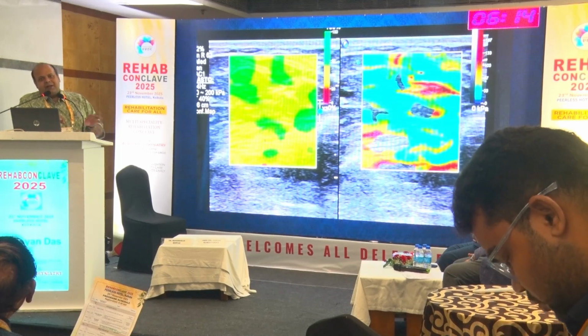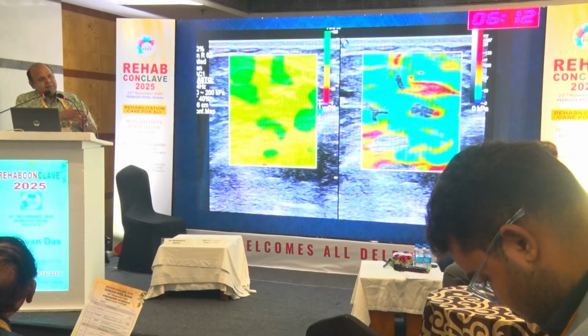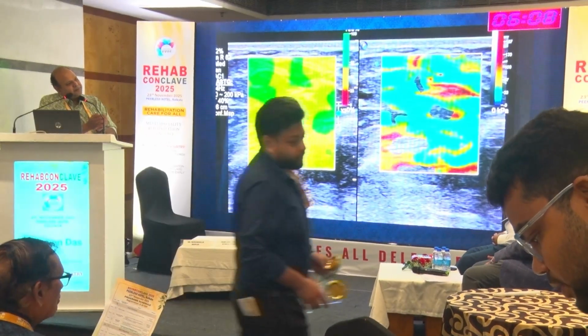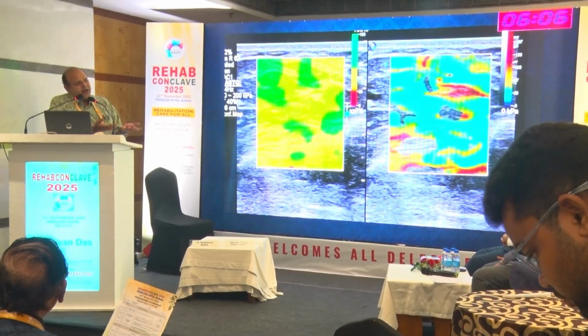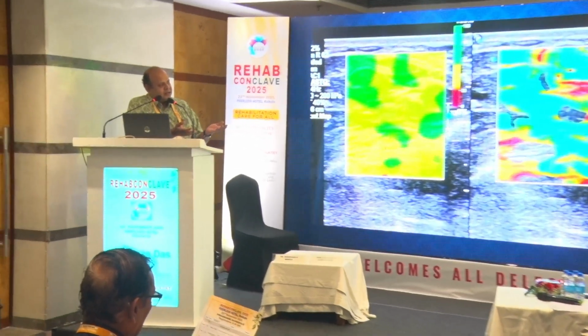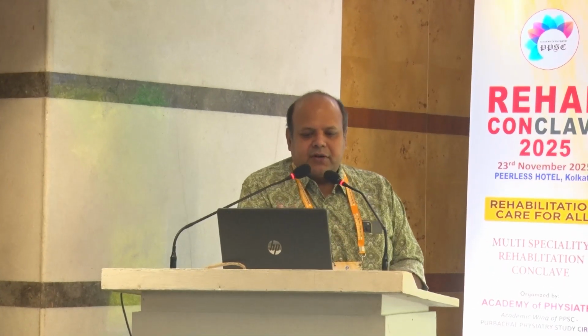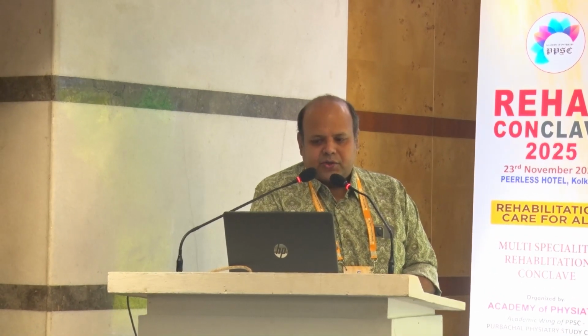So the bone and the blood vessels: blood vessels are pulsatile structures, so they never keep the normal shape. And the bones are the toughest ones because they do not change their shape on elasto. So they are predicted as red. So we put our interest in the green or yellow zone.